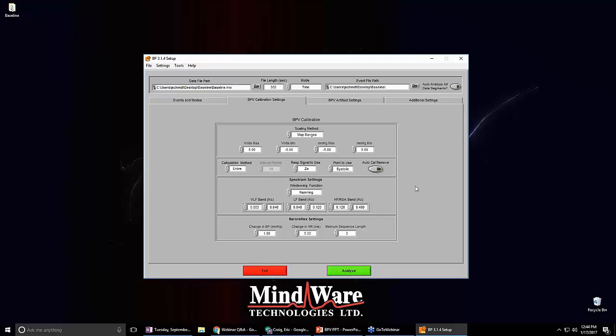You'll also find, in the article that I brought up before, knowledge base number 12, that it'll show you where to go, what settings, and which one you should choose. Just a note on this one, everyone's ranges are going to be different, whether it's the map ranges or the slope intercept here, so please see that knowledge base article. There's a picture inside the knowledge base article, but that's just the default. So please read your manual on your CMAP also.